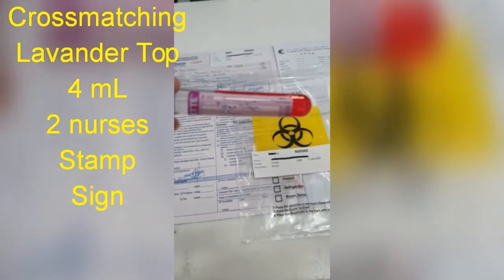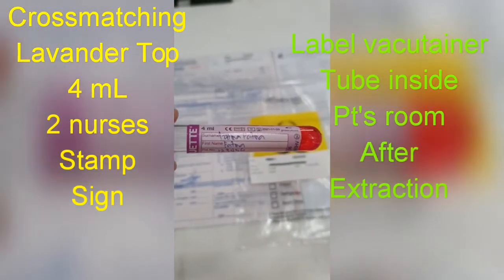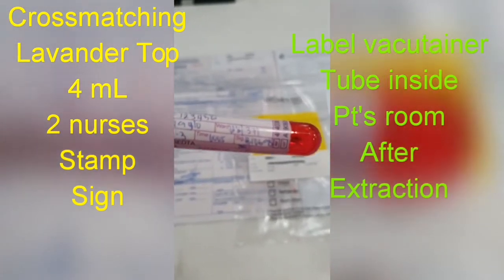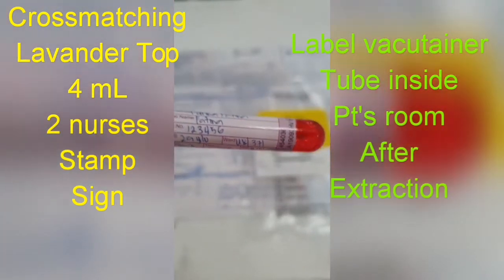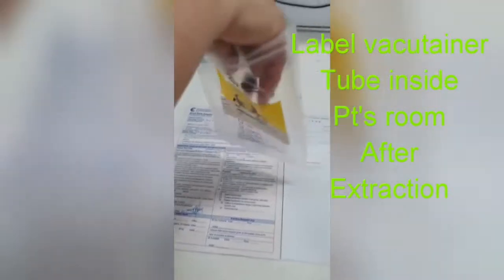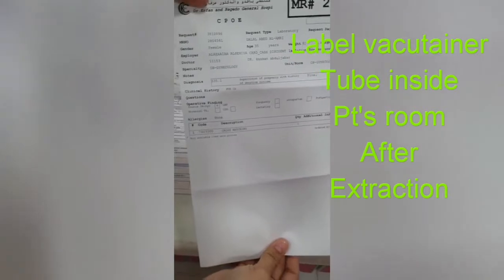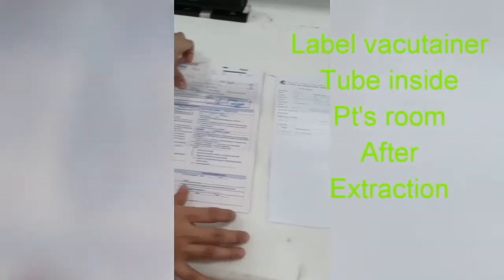Specimen tube to be labeled properly with patient's name, MR number, the collector's initials, and the date and time the specimen was collected. It is then to be placed in a biohazard bag with an insert of the hard copy of the requisition and the blood bank request form.